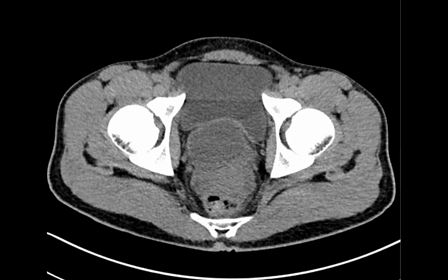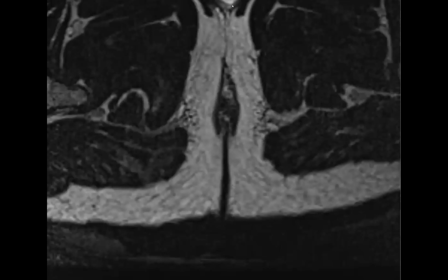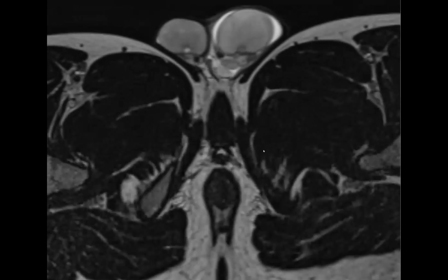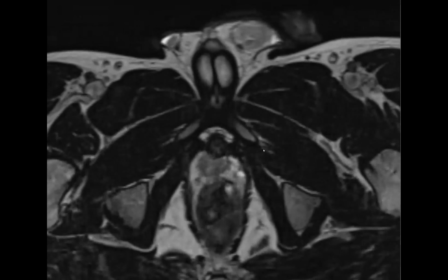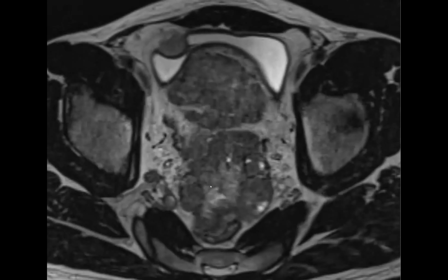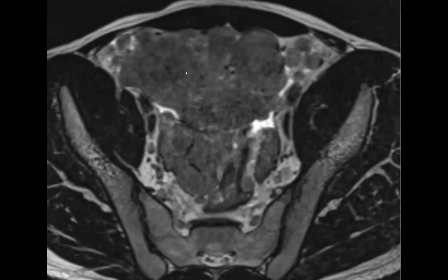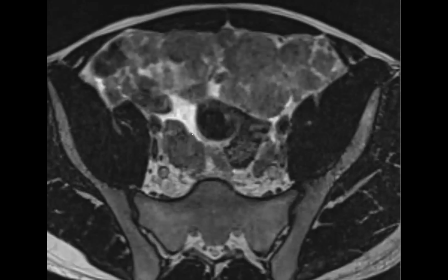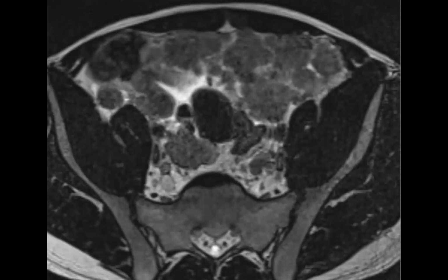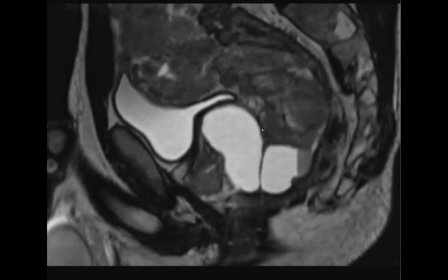So the patient came for an MRI. And this was the MRI. So we can see that there is that cystic mass here. We still don't know what exactly this is, although I think it's part of this whole process. And then you can now nicely see all this gray of tumor, like peritoneal carcinomatosis in the pelvis. So we definitely thought this looked malignant, and it went for percutaneous biopsy.